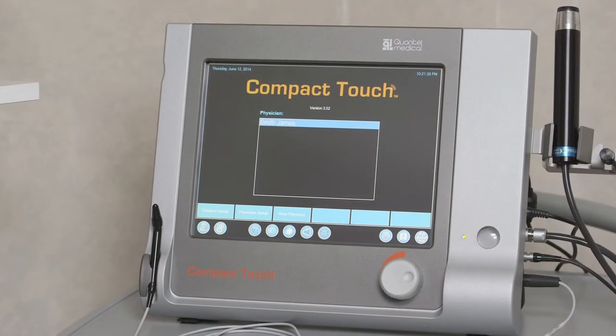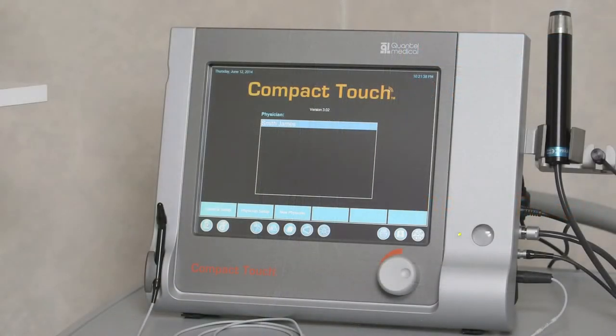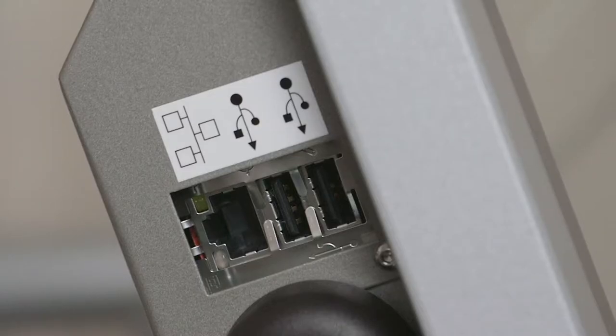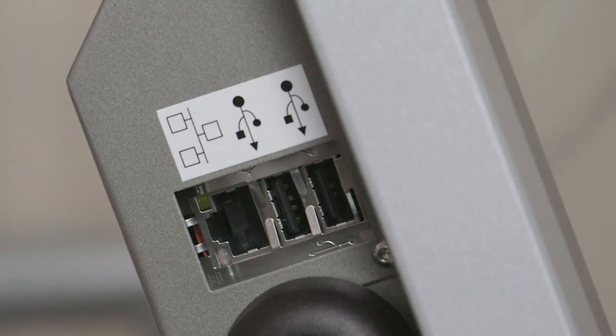The portable, versatile Compact Touch can be used for A-scan, B-scan, IOL calculation and corneal pachymetry. The stand-alone device requires no computer connection and can be controlled entirely via the touch screen. The unit is equipped with USB connections for mouse, external keyboard or file storage device.